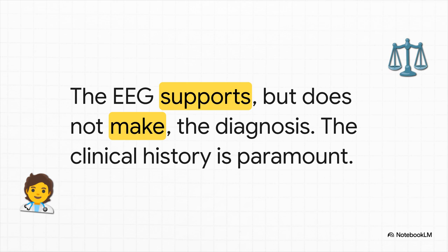The EEG provides data. It gives us clues. It offers supporting evidence. But it is not a verdict. The diagnosis of epilepsy is made by you, the clinician, by carefully listening to your patient's story and putting all the pieces of the puzzle together. The EEG is there to support your judgment, never to replace it.